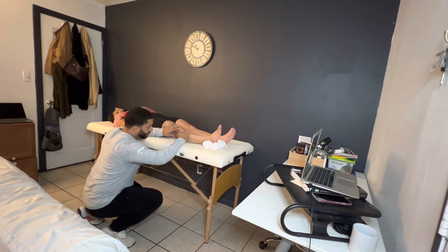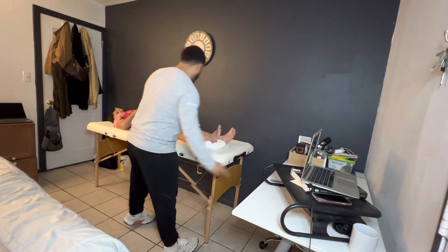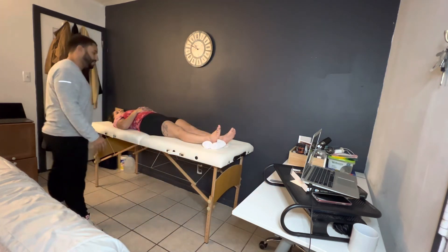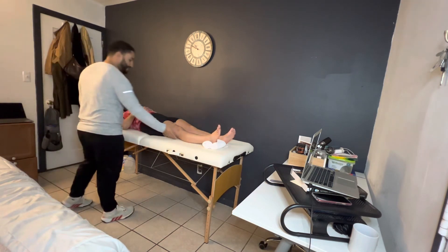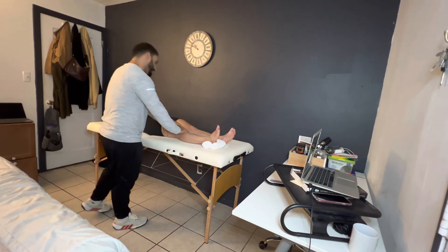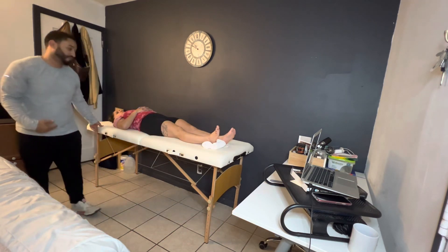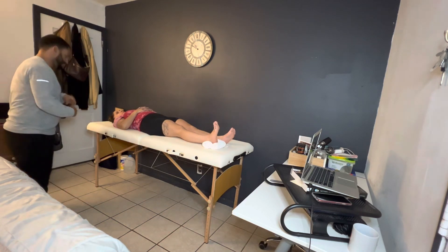Our right knee in extension is about five degrees, and in flexion is about 140 degrees — pretty standard, pretty healthy stuff in that right leg. We're going to go ahead and check out that left leg just to make sure we're balanced. Anything to tell me about this knee extension position? Any discomfort when I push down on that leg? All right, we're going to make sure we try to improve that extension position just to make sure we're staying healthy. But overall, I like what I'm seeing.